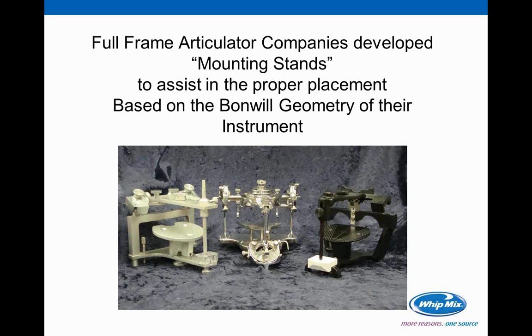Now, most full-frame articulator companies have come up with some kind of mounting stand to assist you in the proper placement, and most of that is based on Bonwill geometry and how it fits in their instrument. So if you have large frame articulators, you should look into some kind of mounting stand for that articulator. If you're not using either a Whip Mix, a Denar, or a Hanau articulator, then I would suggest contacting your articulator company to find out if they have some kind of a mounting stand that you could use.